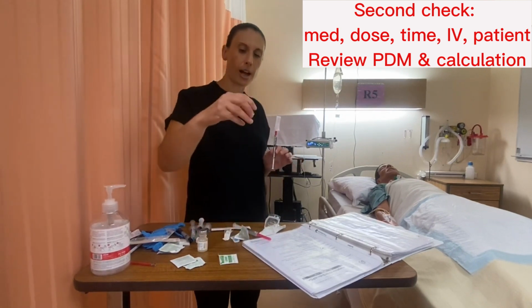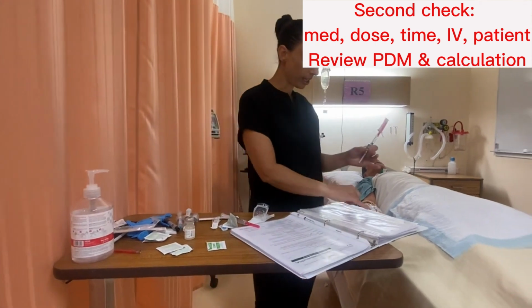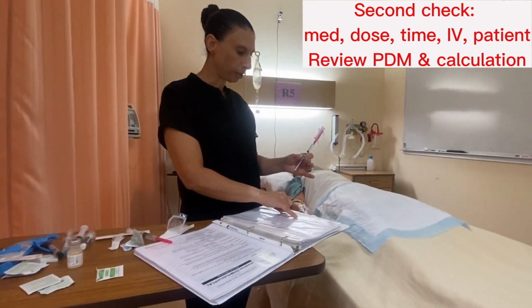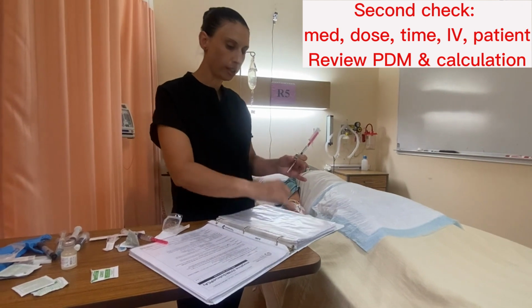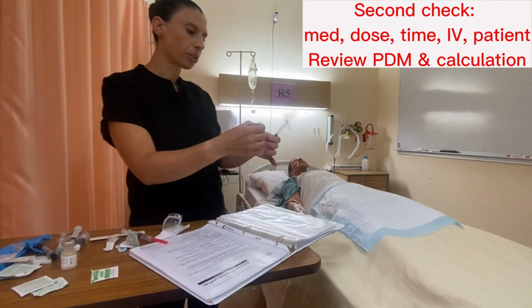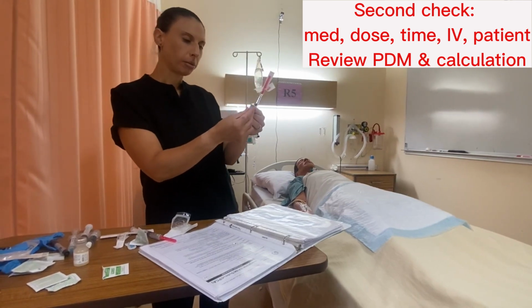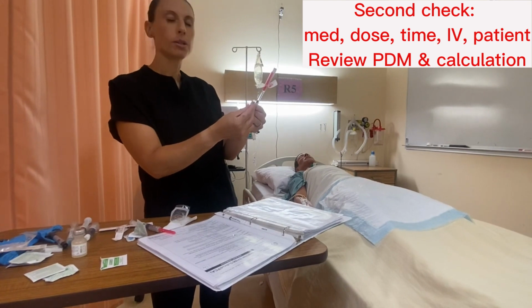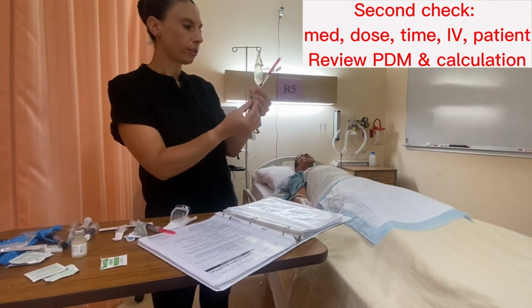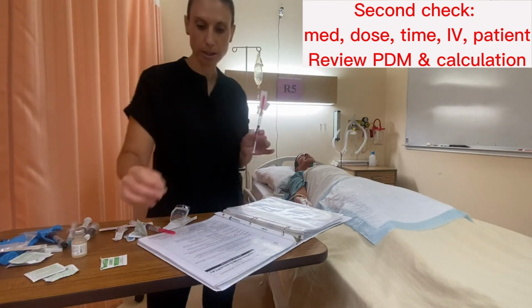All right, so we're going to grab our vial in hand and we're going to check our physician orders again. Morphine, 5 milligrams. 5 milligrams, perfect, has not been given. It's an IV dosage and it is for the correct patient. Now with syringe in hand, I'm going to look and verify my calculation. 10 milligrams per 1 ml. I need 5 milligrams. That equals 0.5 mLs. And I'm going to visually check my syringe. I do have 0.5 mLs in this syringe, so that is perfect.